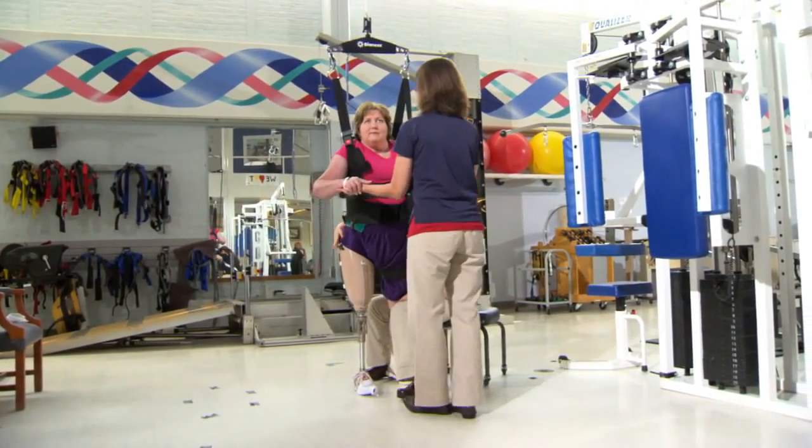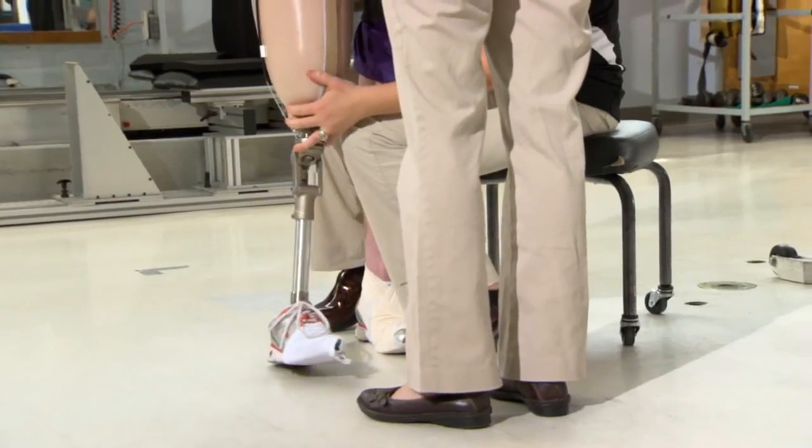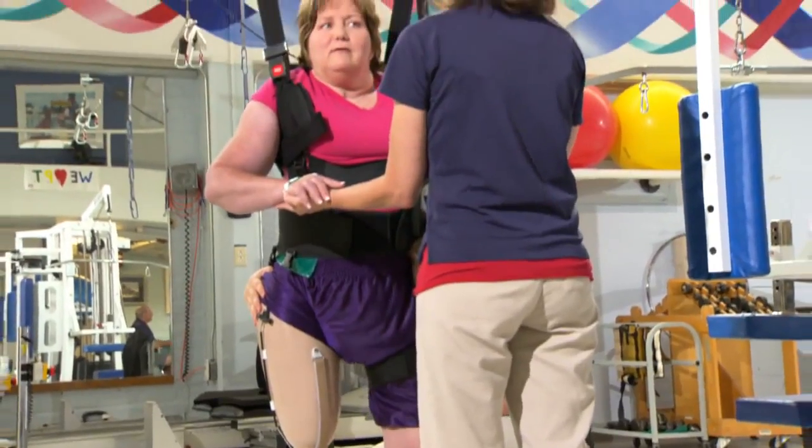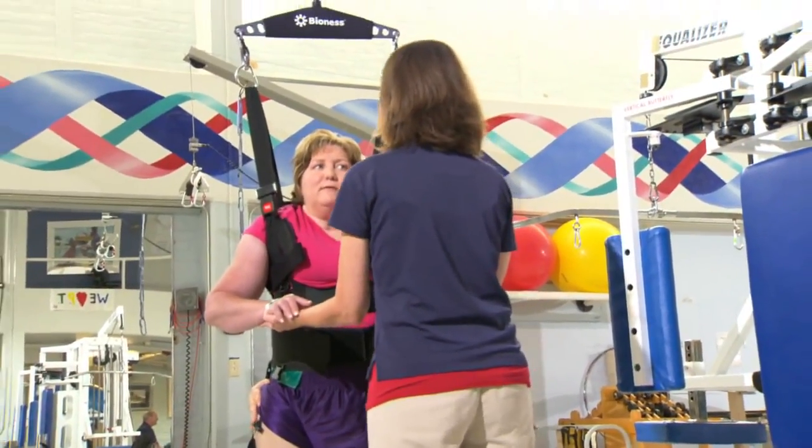She did have an episode where she fell and the Vector caught her. We gave her some pointers. We wanted her shoulders back over her hips, and then she started learning to trust her knee a little bit more without having to be over it. And when she made that next long stretch, she actually walked further than she'd ever walked before and had no back pain. It made a pretty big impact on her function at that point.